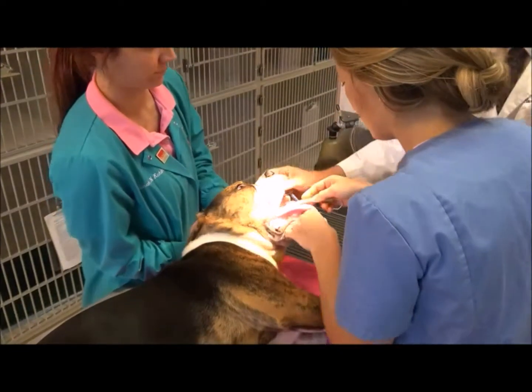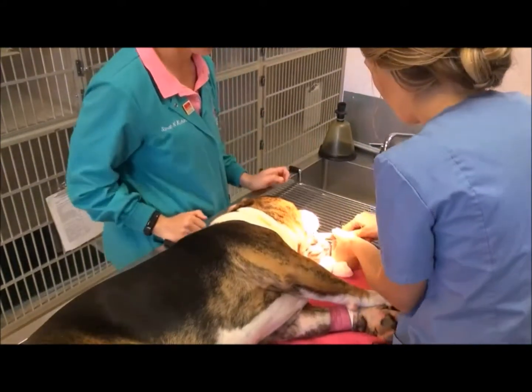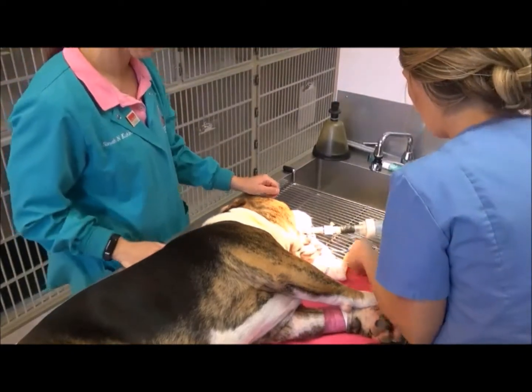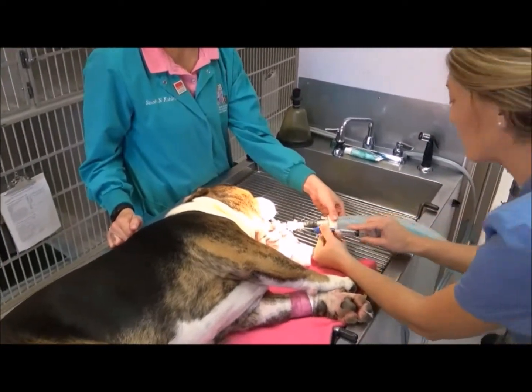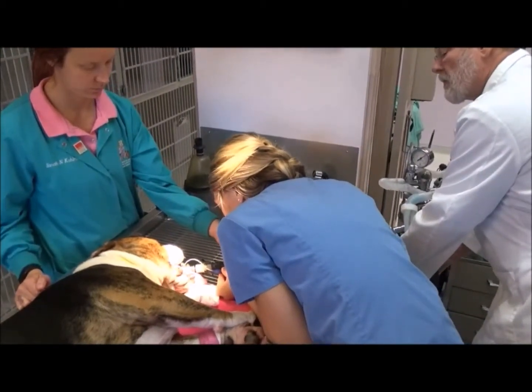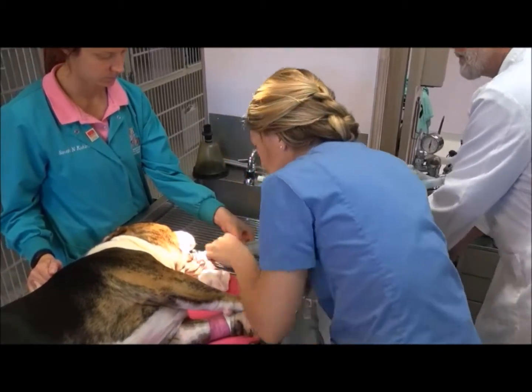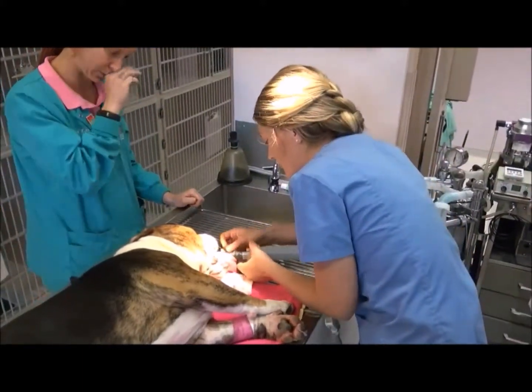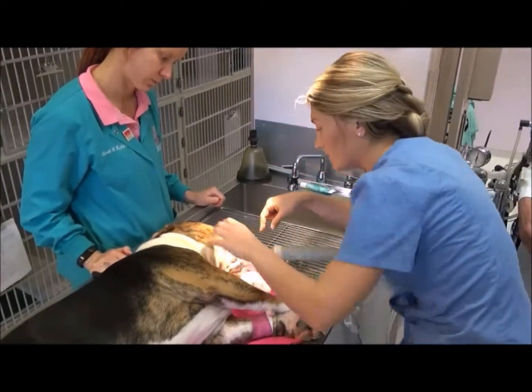Okay, that's perfect. So we're going to reconnect the breathing tube here. And then we're going to inflate the pressure cuff. So I'm just going to close up the pop-off valve. And I'm going to inflate until I don't hear any air leaking from around the cuff. And then I'm going to connect the mouth gag to this clip here we have on the rebreathing hose. This is what's going to keep the endotracheal tube in place.